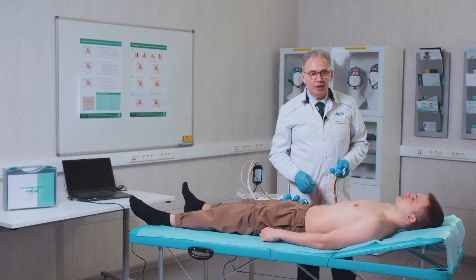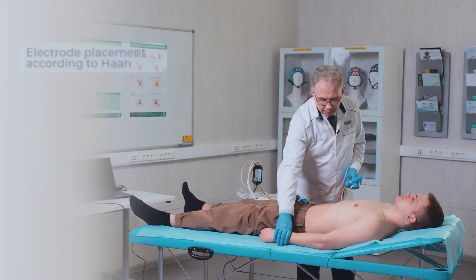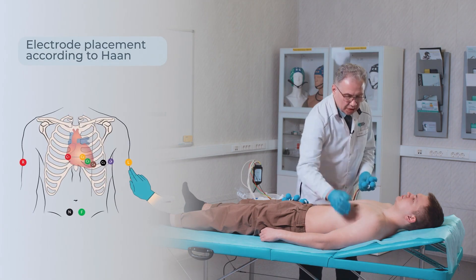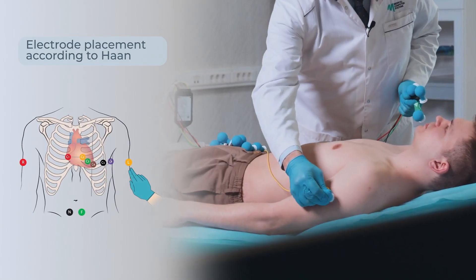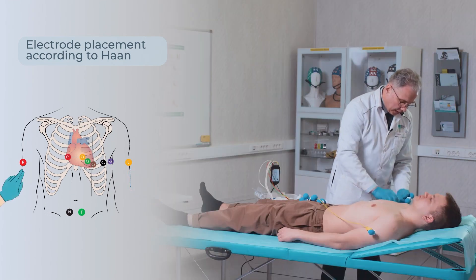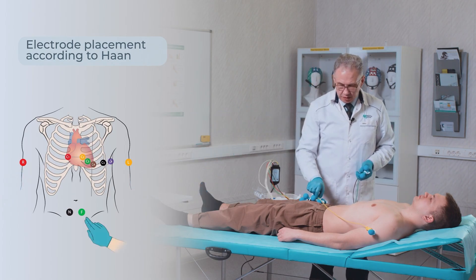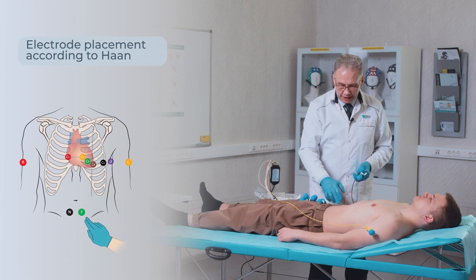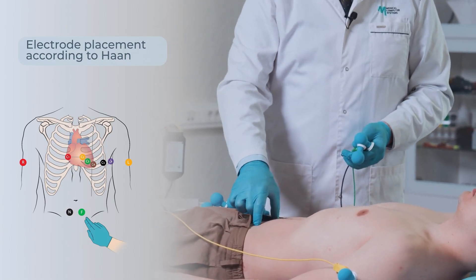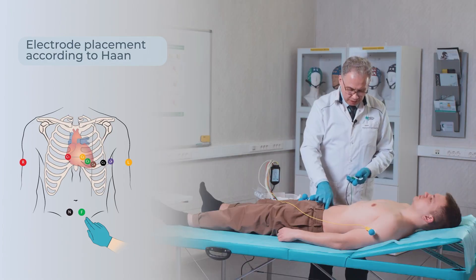For proximal dislocation of electrodes according to Haan, the electrodes from the forearms are moved to the shoulders on the outer surface under the deltoid muscle. The yellow electrode is placed on the left arm, the red electrode on the right arm. The electrodes from the shins are moved to the front surface of the abdominal wall, seven and a half centimeters below the navel in adults and symmetrically on the left and right at a distance of approximately five to seven centimeters from the midline.